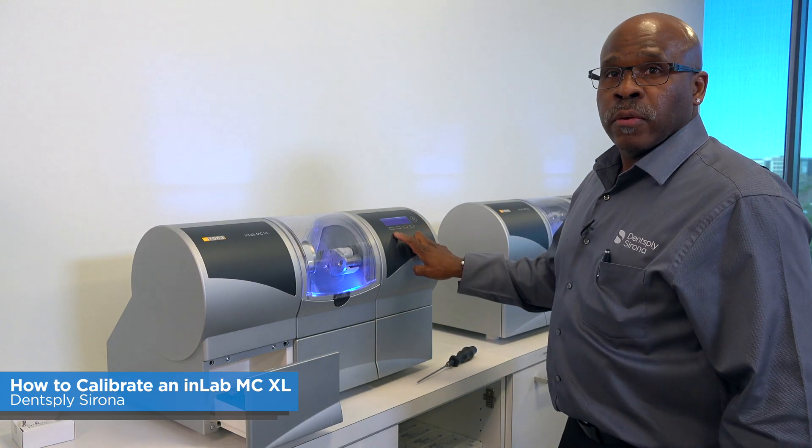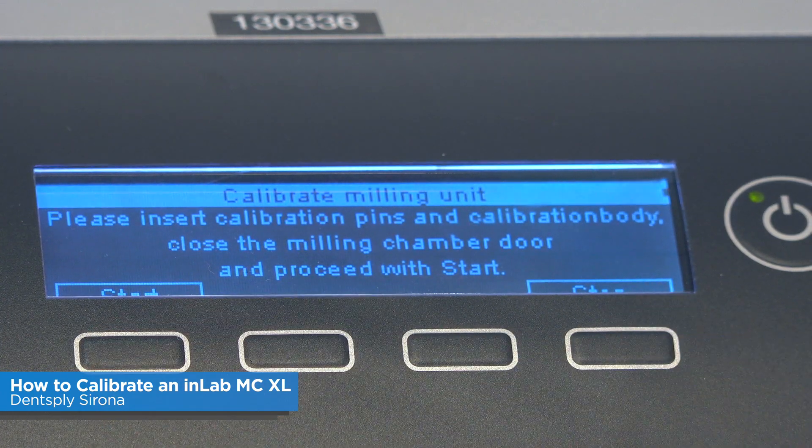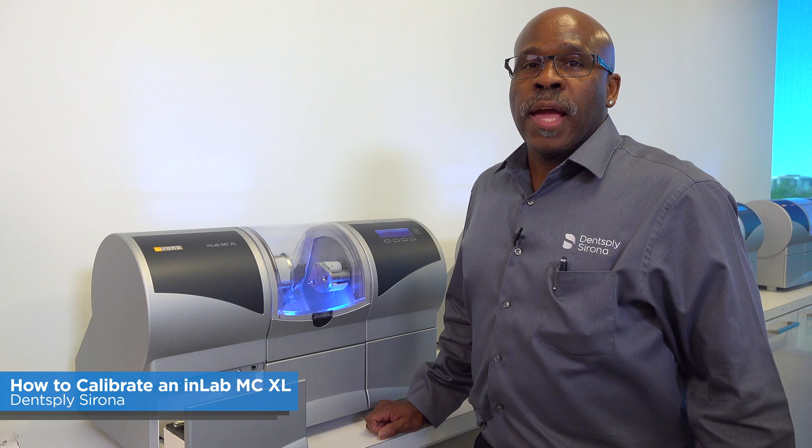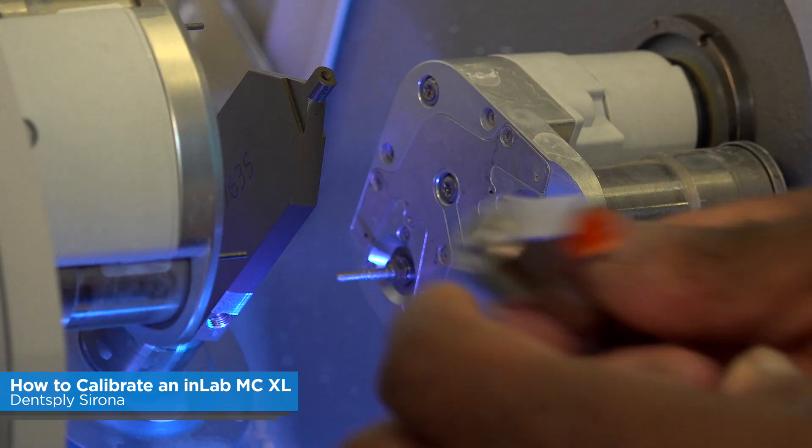You can start calibration either from the front of the milling unit or at the computer. At this stage, calibration is finished for motor set number one. Now you need to tell the machine what burs you're going to be milling with and place the burs in.